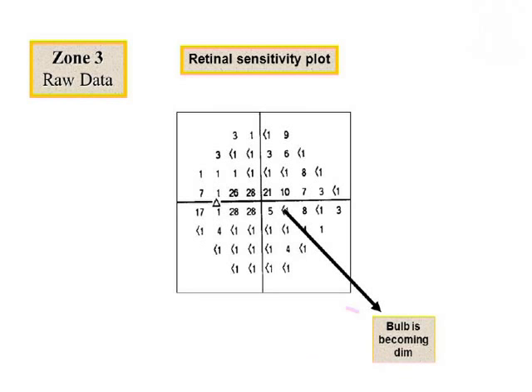If you see any sign in front of a number, that means the maximum intensity of light is not 10,000 and it is somewhere around 9,000, and it requires recalibration of the machine or the bulb should be changed.